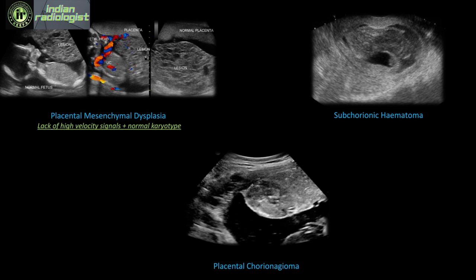Differentials for these appearances include placental mesenchymal dysplasia, which is rare but lacks the high velocity flow seen in molar pregnancy, and these babies tend to have a normal karyotype. Subchorionic hematoma is encountered often; atypical features should prompt consideration of molar pregnancy. Placental chorioangioma is relatively rare but can have a similar appearance. In all these differential cases, beta-HCG levels will be normal, which is why a multifactorial approach is essential.